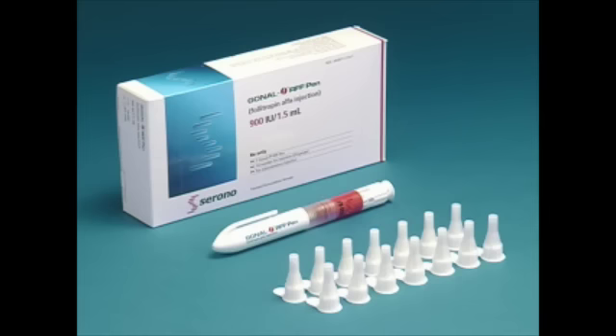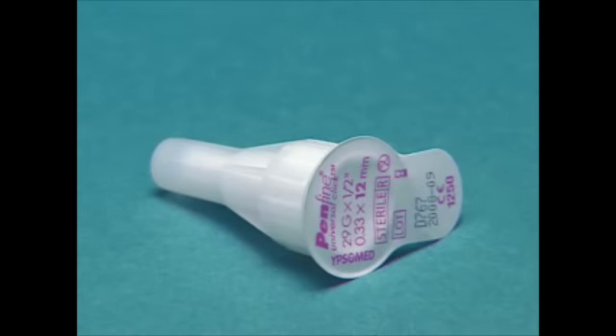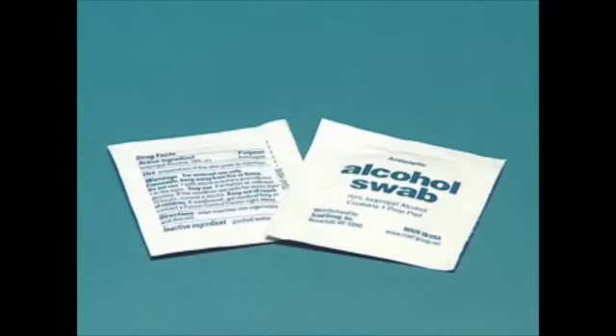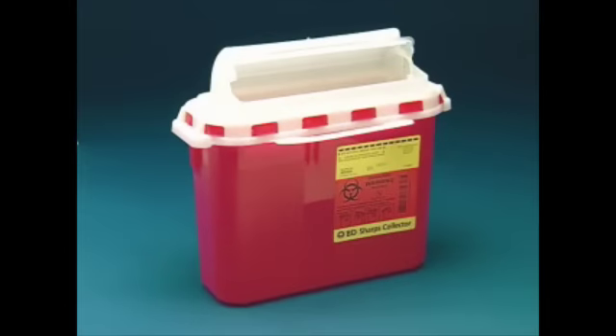Be sure to have all of the following items before you begin: the Gonalef RFF Pen, one single-use disposable needle supplied with the pen, alcohol swabs, sterile gauze pads, and a safety container.